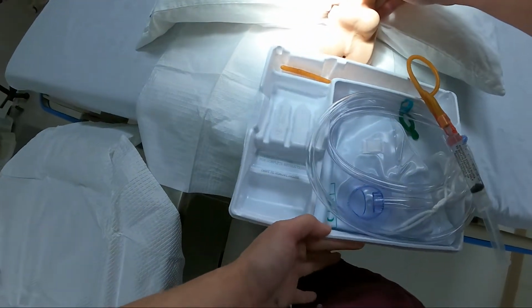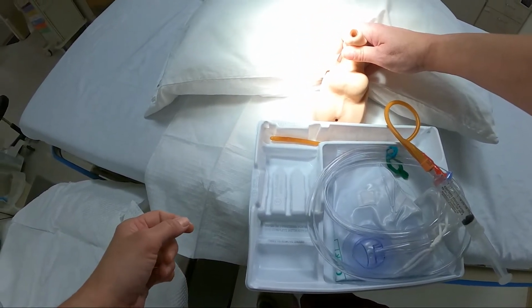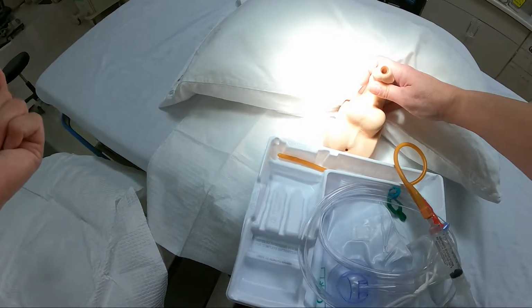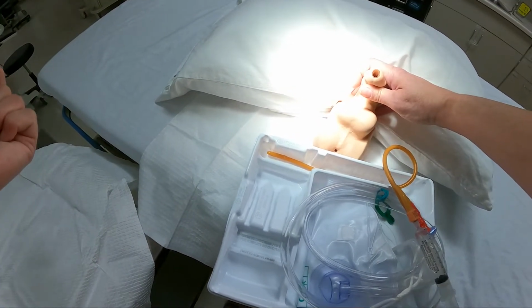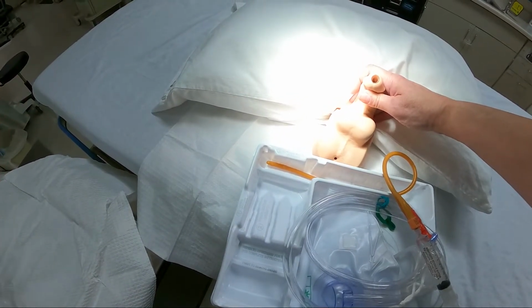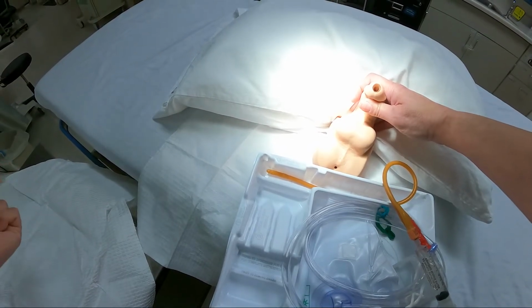Now, may not have enough, there we go. Now, for men, sometimes, especially elderly guys, you may need a Urojet, which is lidocaine, which is KY jelly with lidocaine. It takes an order from a doc.